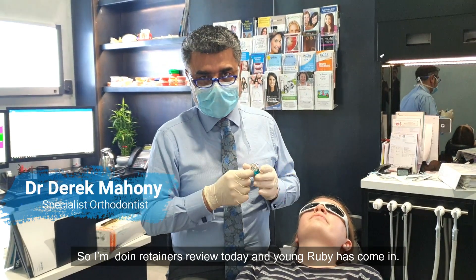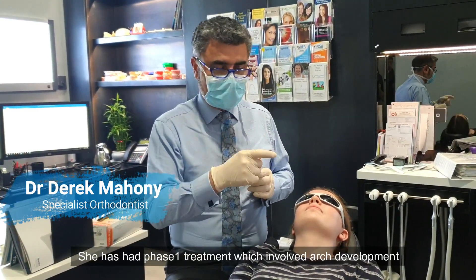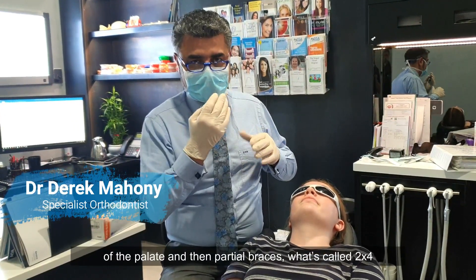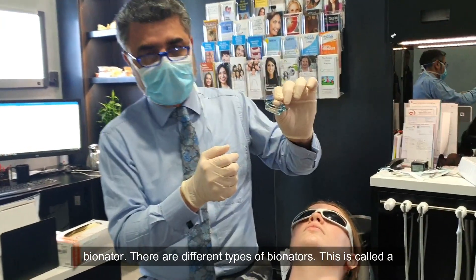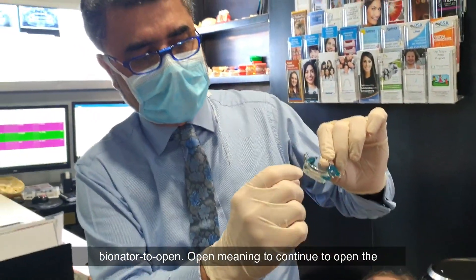I'm doing retainer reviews today. Young Ruby has come in — she's had phase one treatment, which involved arch development of the palate and then partial braces, what's called a two-by-four, to open the bite. To maintain that, we use what's called a bionator, and there are different types. This one is called a bionator to open.